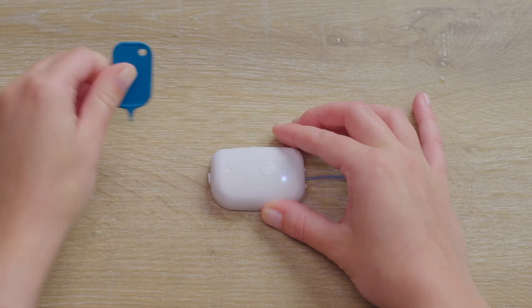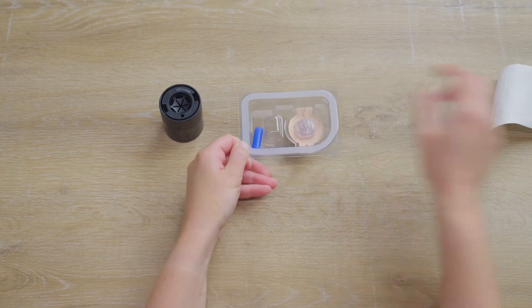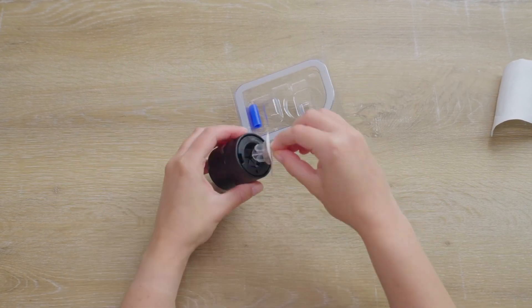A tool is used to actuate the priming button. It's now time to move to attaching the infusion set.